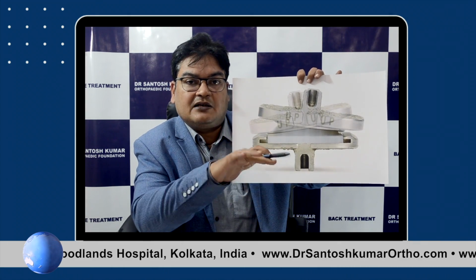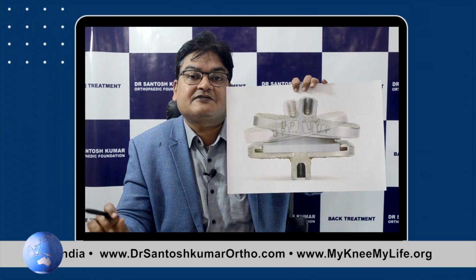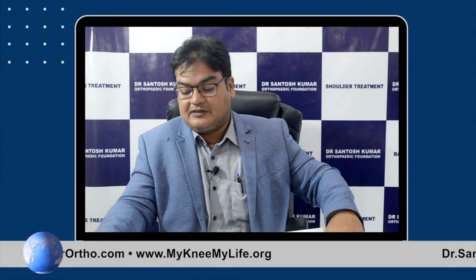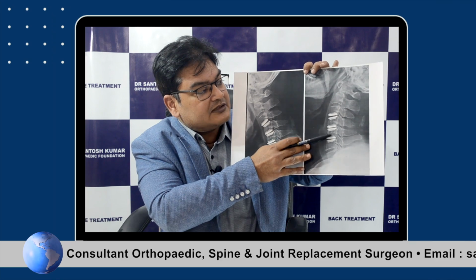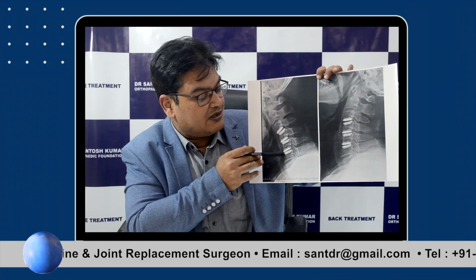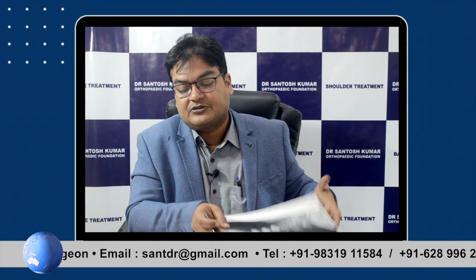So multiple level movement takes place as compared to fusion, wherein the disc space is fused. Here also multiple level movements are taking place. In the X-ray we can see that this disc replacement is allowing the movement to take place. Like here the person is looking upwards, so it has allowed the movement to take place. Here the person is looking downwards, so the disc has adjusted according to that. It allows the various level movements to take place.